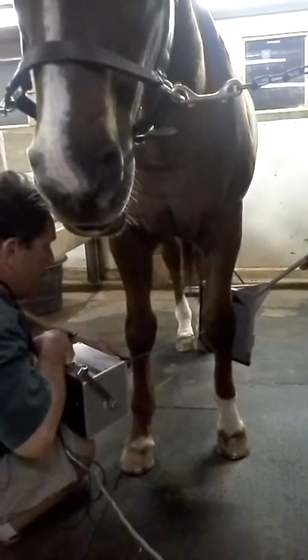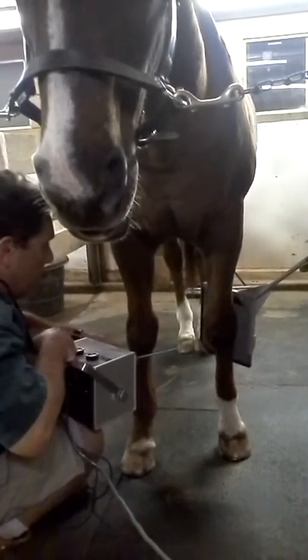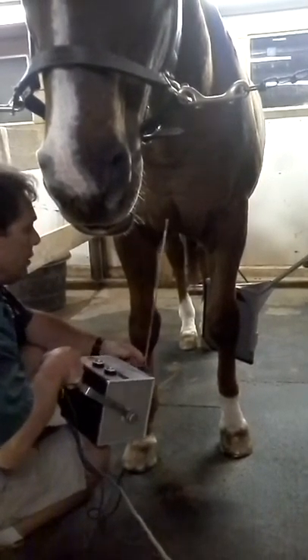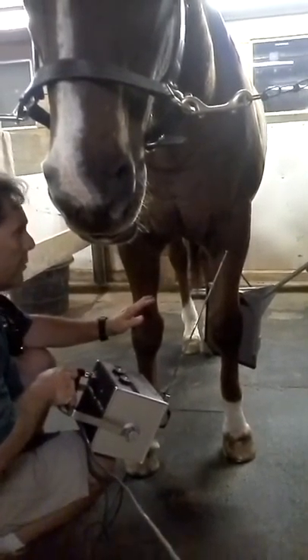If this beam is aiming down, I'm not going to get straight across. So as an operator, what you need to do is make sure that you have it in the right position.